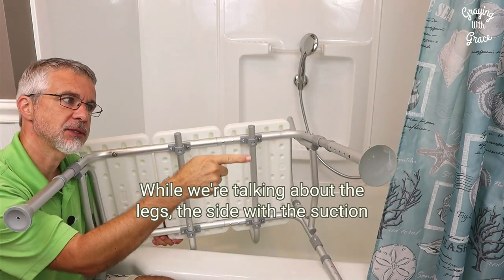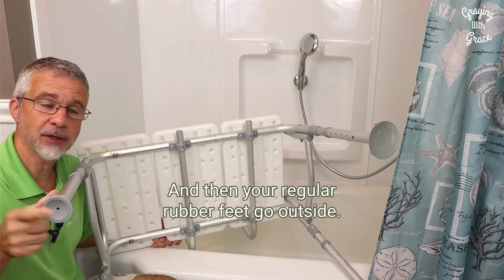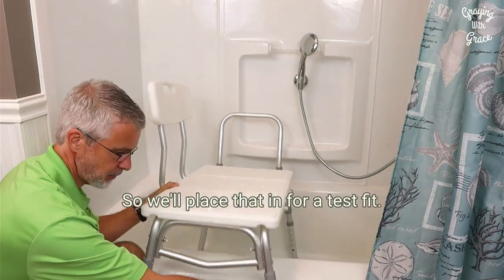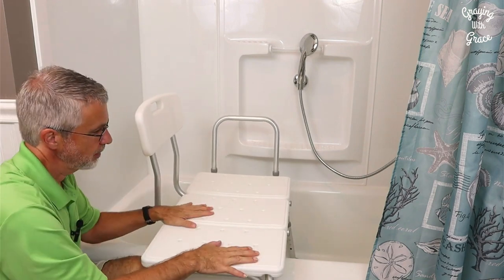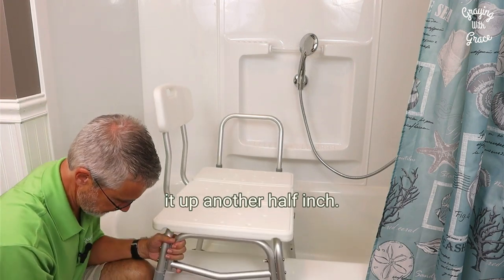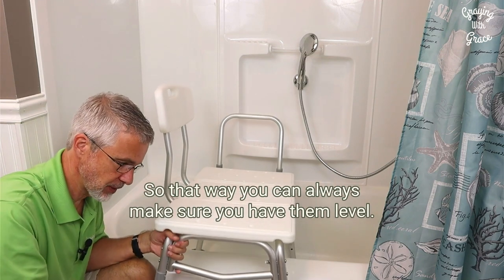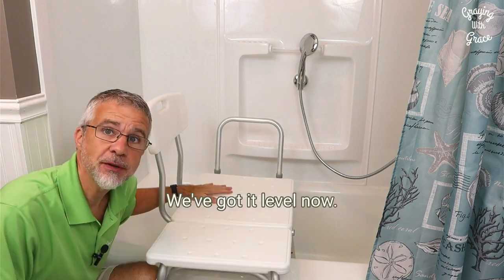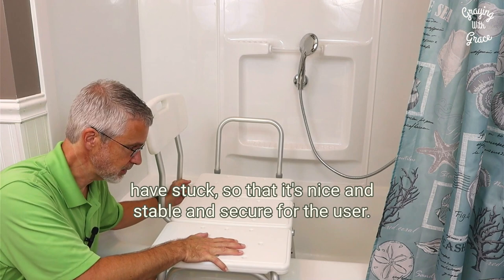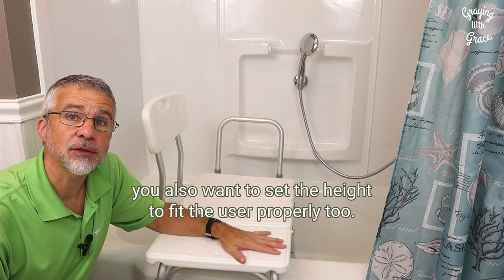This particular model even has half-inch adjustment increments so that way you can really get a nice level fit. The side with the suction cups goes inside the tub — the suction cups help stabilize it, and then the regular rubber feet go outside. We'll place that in for a test fit. This side is still a little bit lower so I'm going to adjust it up another half inch. This model has a number on every hole so that way you can always make sure you have them level. Once we've got it level, you also want to make sure that the suction cups on the back have stuck so that it's nice and stable and secure for the user.